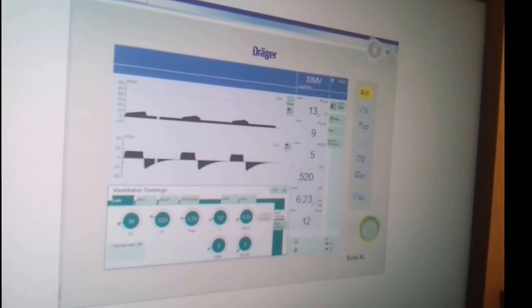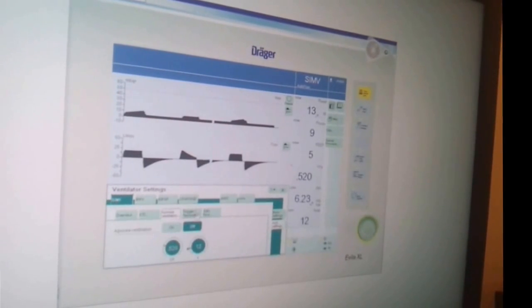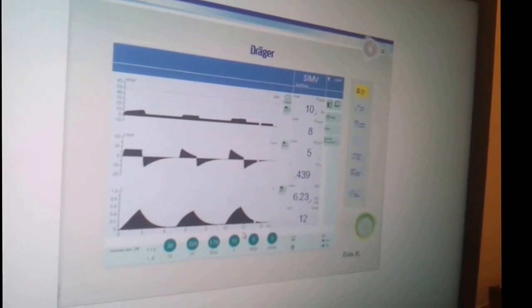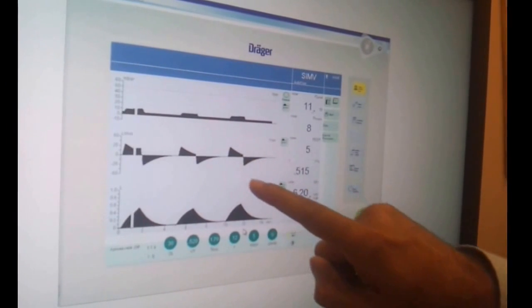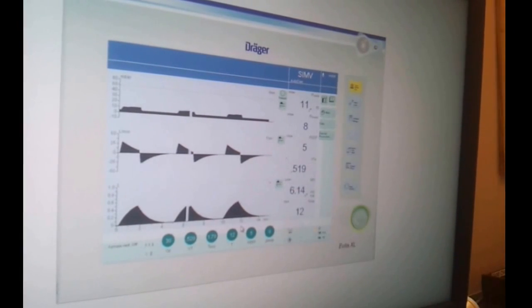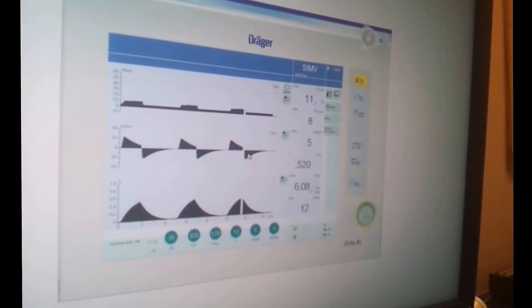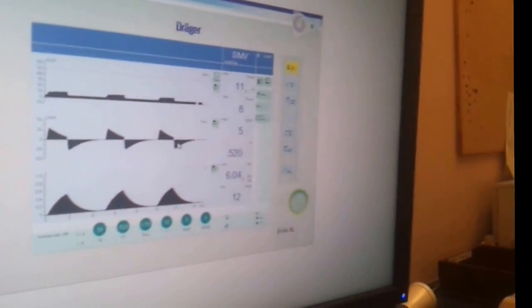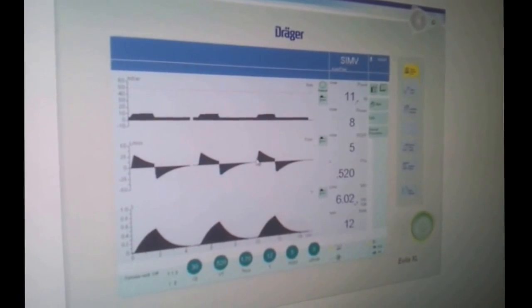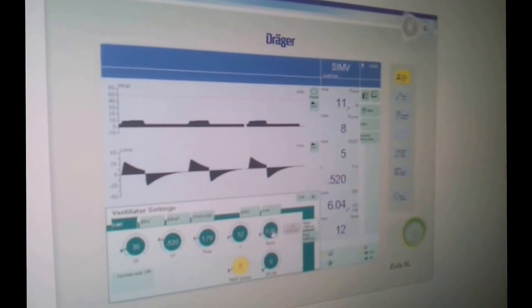Now, autoflow determines the rate of inspiration. So there must be the deceleration of flow. There you go. You see, once the autoflow is turned on, it determines by itself how it's going to deliver the volumes. Initially, with autoflow, it gives a high flow of air, and then it decelerates. That's the machine doing it. So we can change it to a rapidly increasing one, which is the slope of the curve. Here you see the ramp.